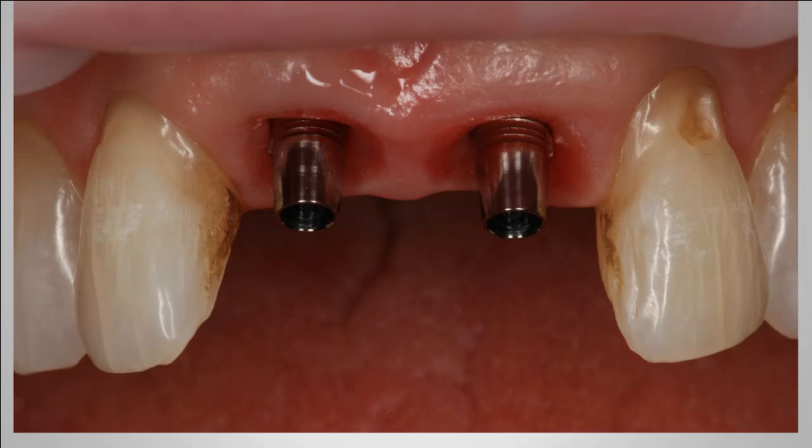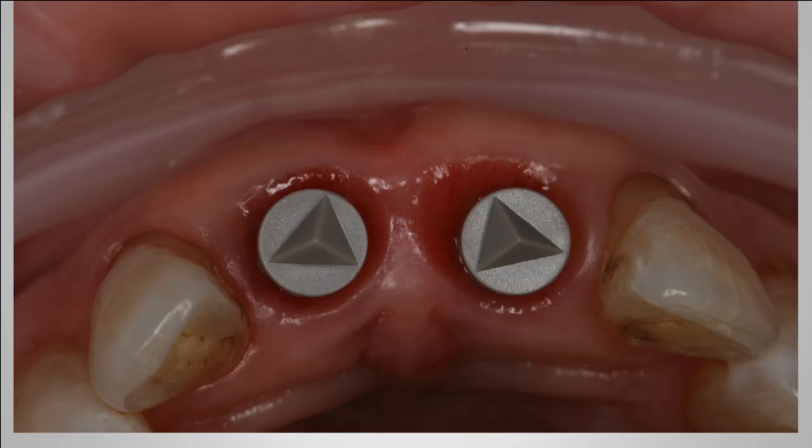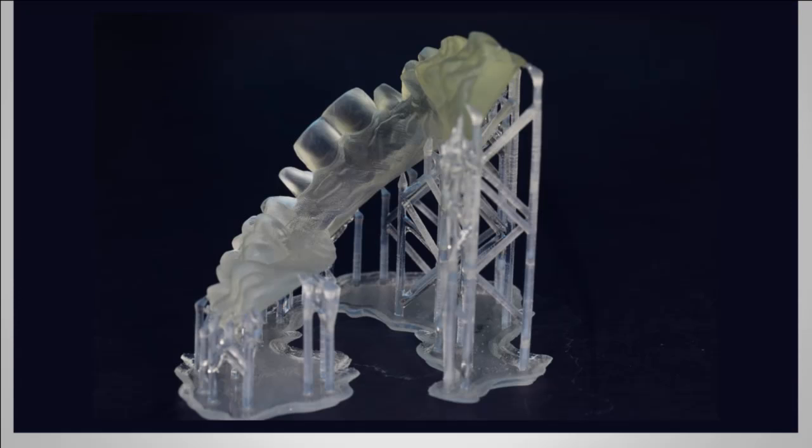Here is where you can see the notch on the tie base on both of these tie bases. And at this stage, since we used 2 of the smaller tie bases, we would use 2 of the small scan bodies and align the notches of the scan bodies with the scan posts. Here is an occlusal view of the 2 tie bases and the 2 scan bodies attached to our 2 implants. At this stage, we can take an optical impression and design our restorations.